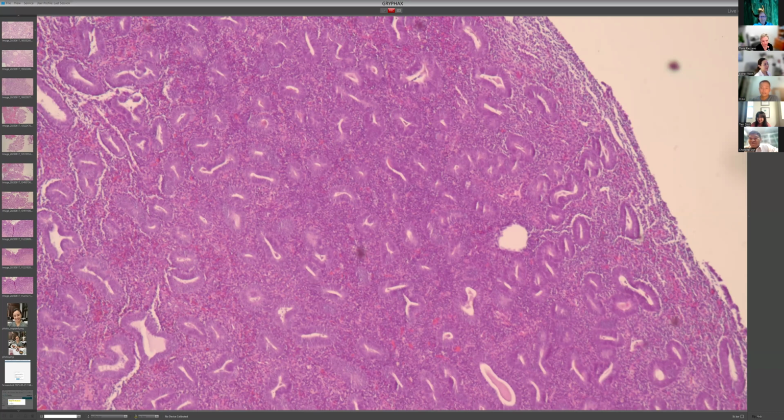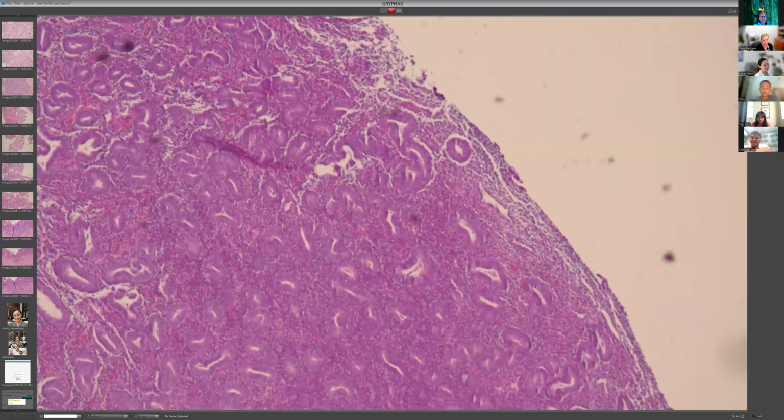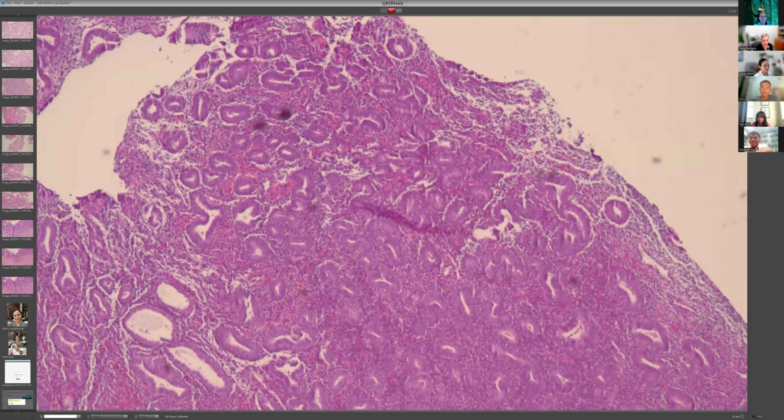This case is crowded. So we see, I think it's a threshold you're gonna build also, and depending on what phase it's in, it can have a little bit of crowding and an increase in the number of glands when you have a secretory phase. Because there was a proliferative phase to have more glands, and now you have secretory, that's really a lot more glands than your baseline. But in this particular case I'm showing here, none of these are secretory glands, right?